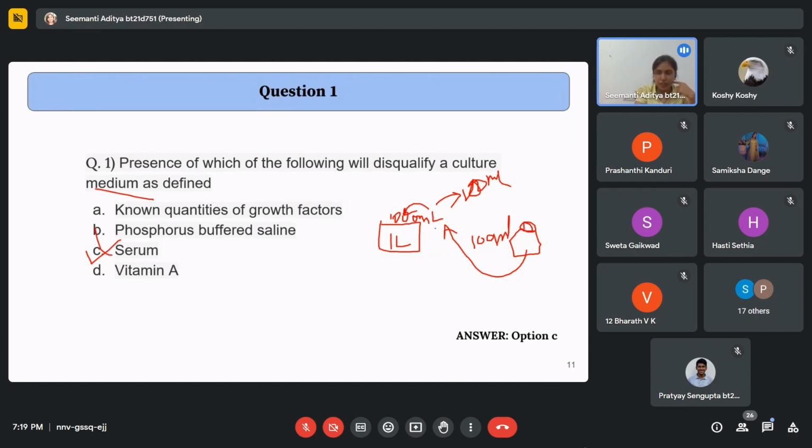In our lab, we use 10% FBS all the time. To the 1 liter packet of media, we add 1,000 ml of water and properly mix so that the powder is totally dissolved.